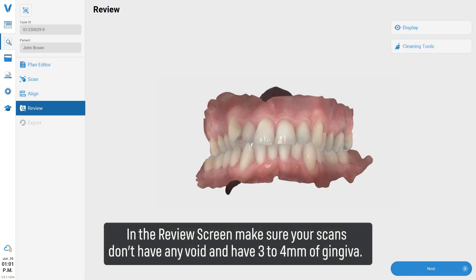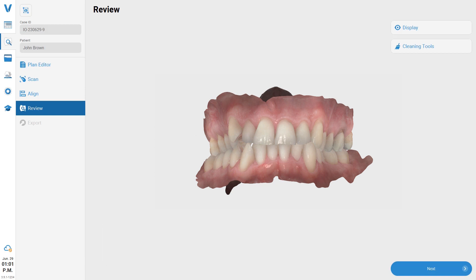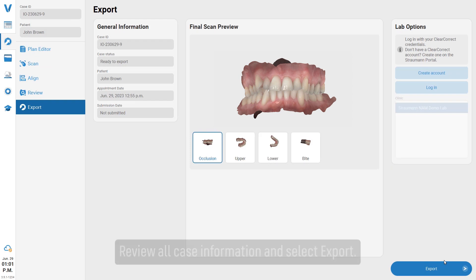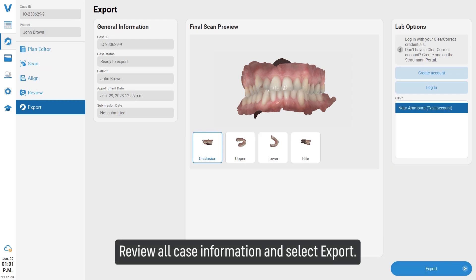In the review screen, make sure your scans don't have any voids and have three to four millimeters of gingiva. Review all case information and select Export.